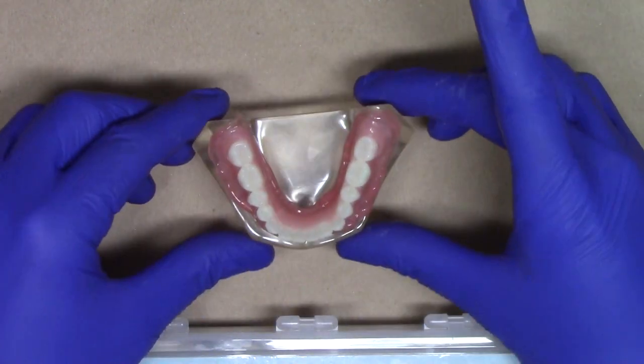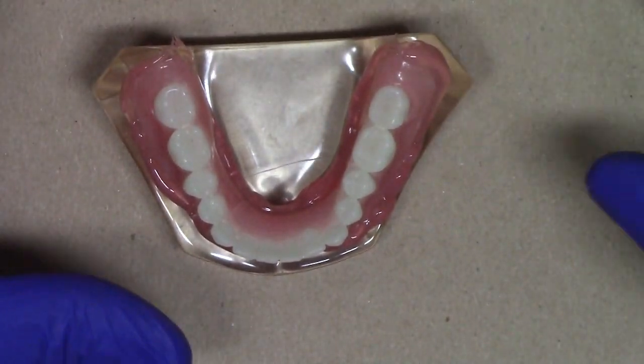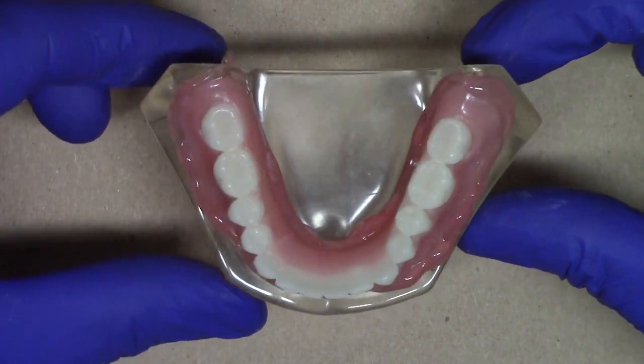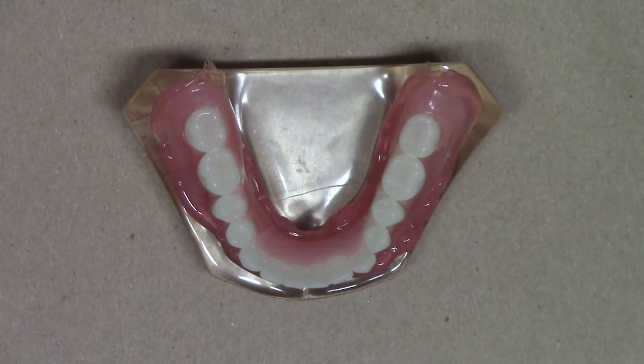This takes about 5 minutes in the mouth for it to set. I have the patient sitting the entire time. Let me zoom in a little bit just to show you. I'd have the patient closed into centric or into MIP the entire time, just to ensure that there wasn't any chance of the prosthesis lifting. Once this is completely set, I'll remove it and show it to you.